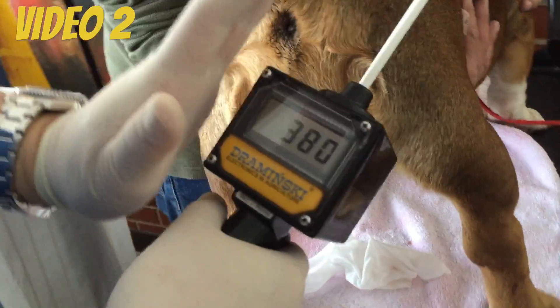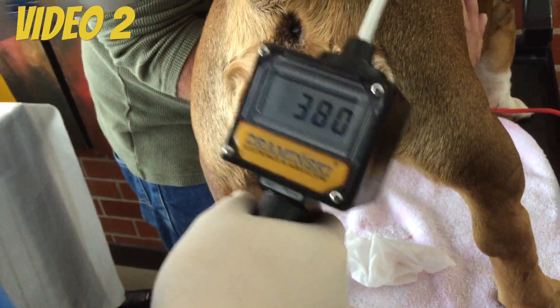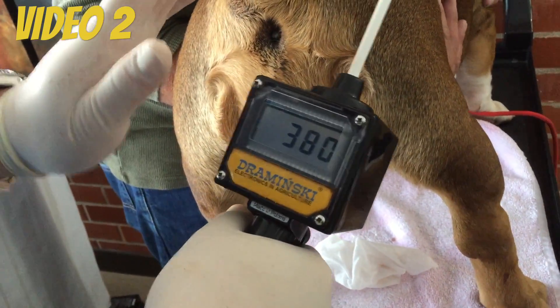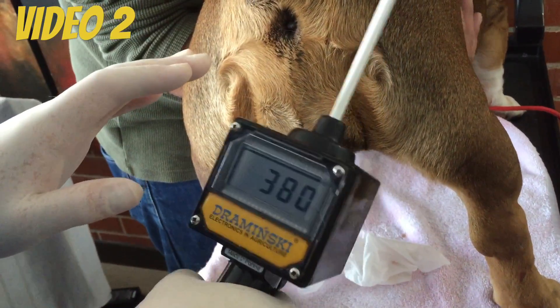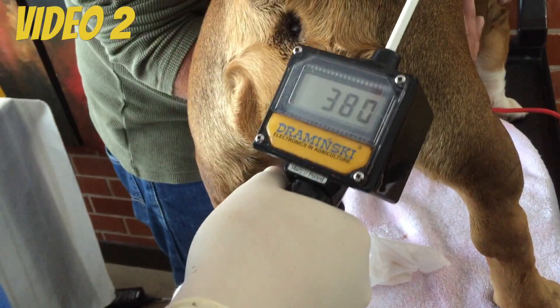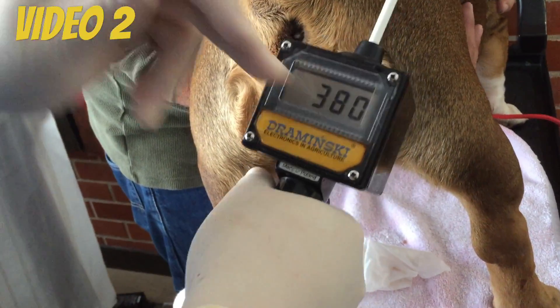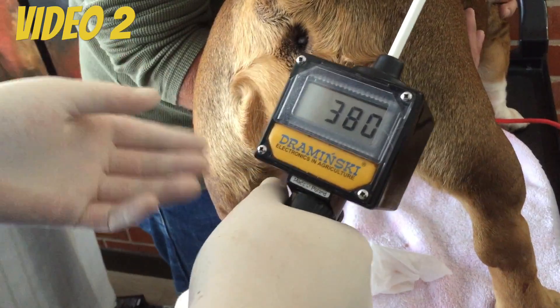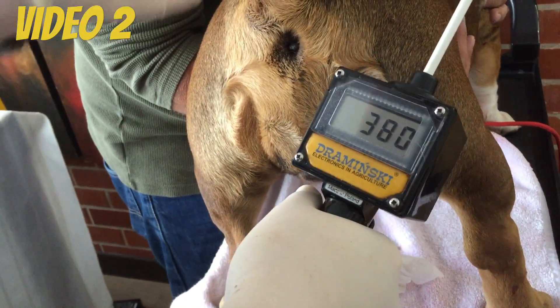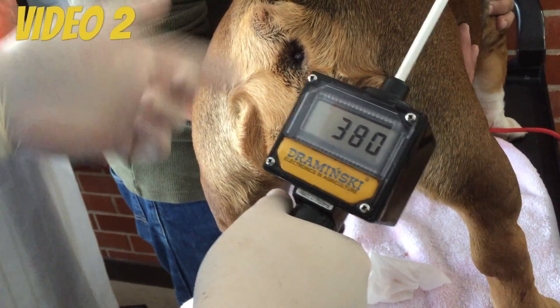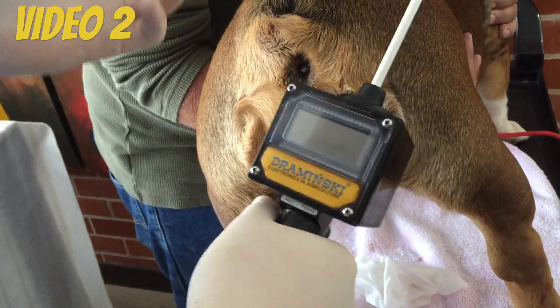So according to the Draminsky, I'm supposed to start breeding her today. That means that there was an LH peak and it dropped. So according to this, the progesterone levels had to have rise. So we're going to go to the smear now.